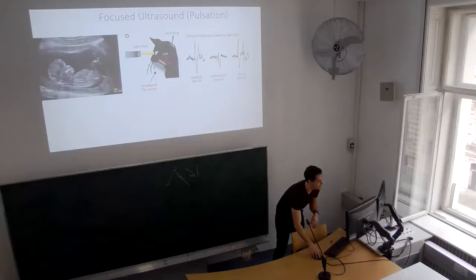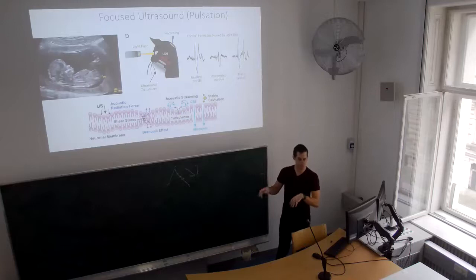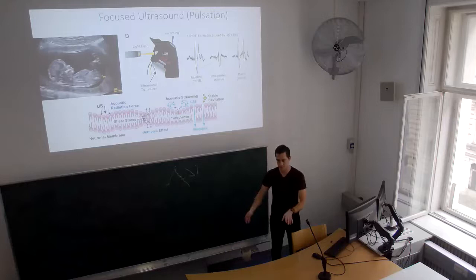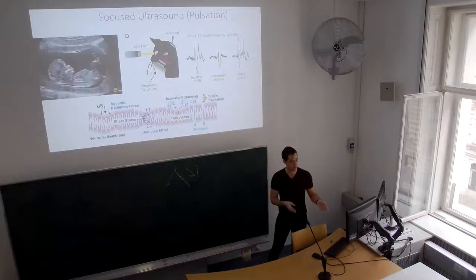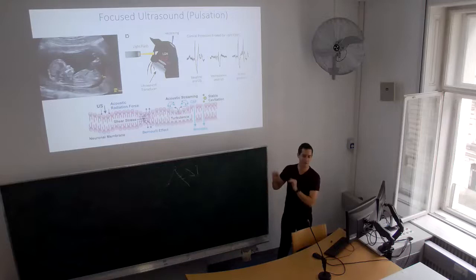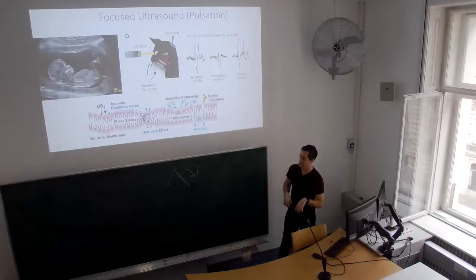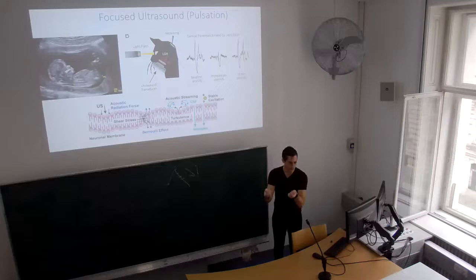When I introduce this topic to most people, the first question I get is usually, how does this work? And the short answer is we don't completely know yet, like all things in science, right? Now that's not that crazy because we also don't know exactly how TMS works, transcranial magnetic stimulation. We know a lot, but we don't know exactly how it works, and the same thing here. So it has to do with the shaking of neurons, okay? Sound is just pressure waves, and what's happening is a really high frequency shaking of neurons and everything inside them, okay?